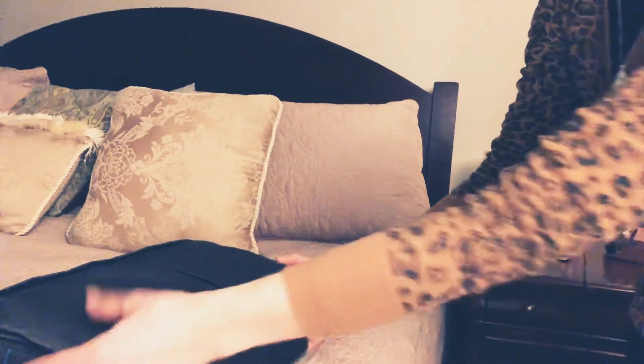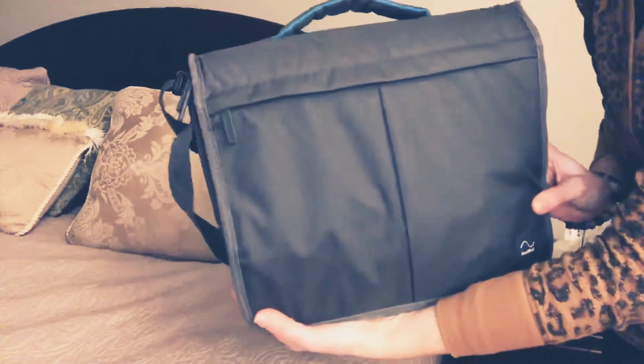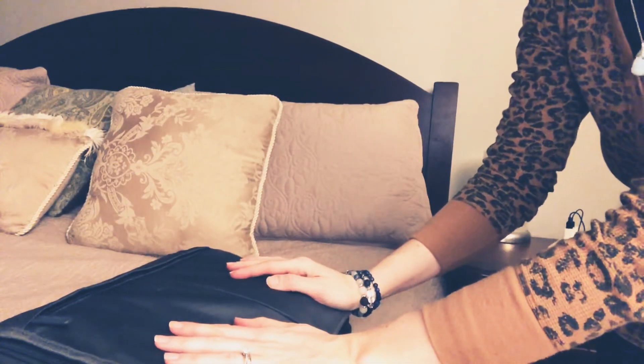Hi guys and welcome to the CPAP Mama. Now that you've gotten set up with your CPAP, it's time to unpack it and get it set up in your room.